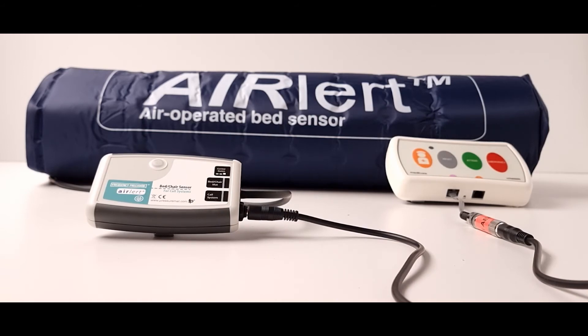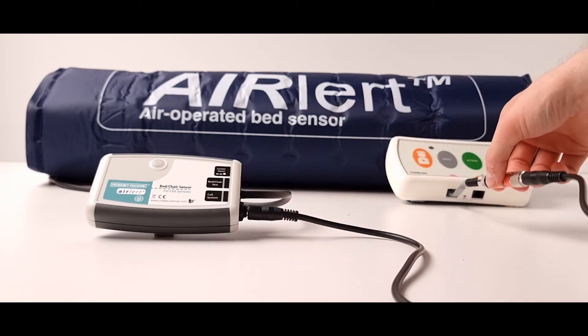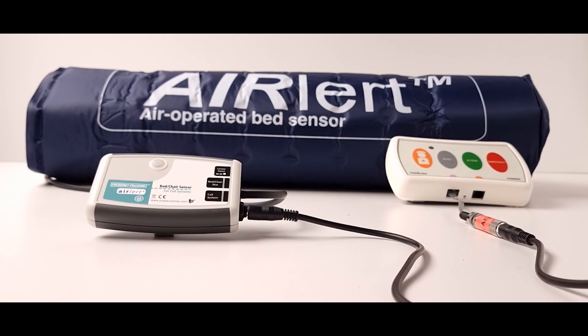The control box will activate the nurse call system in exactly the same way as a wired call bell and we will supply a cable and an adapter which is compatible with your nurse call system. When the patient gets out of bed the nurse call system will be activated.